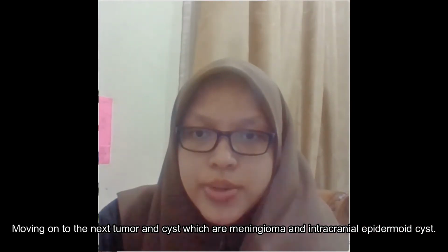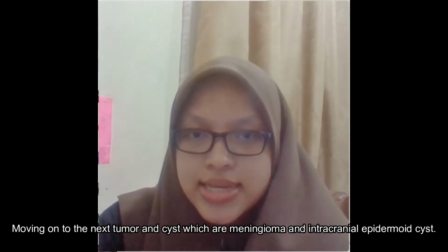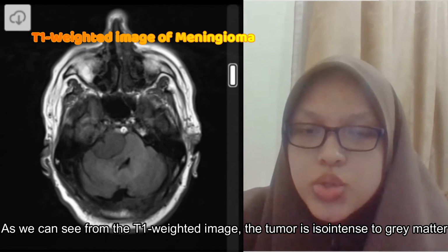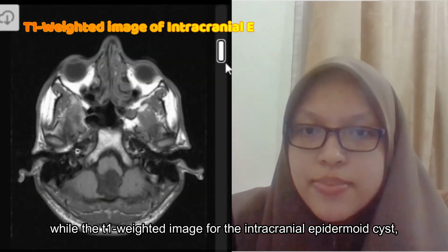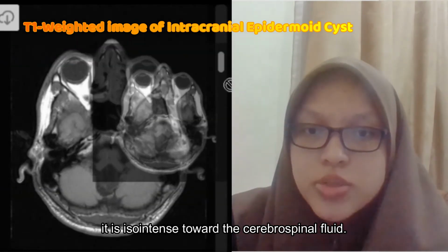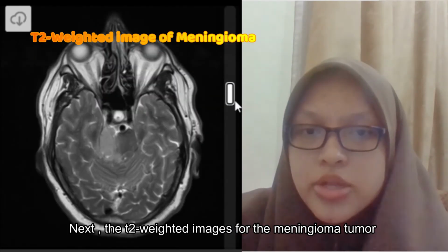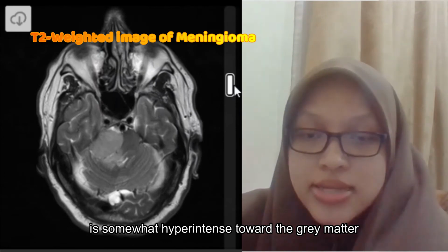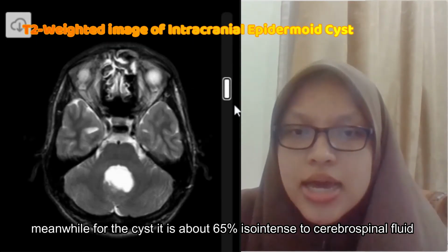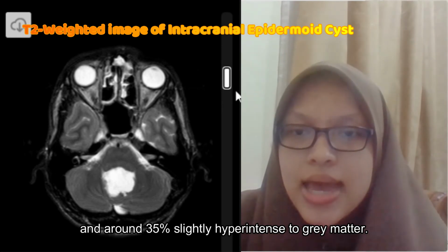Moving on to the next tumor and cyst, which are the meningioma and intracranial epidermoid cyst. As we can see from the T1 weighted image, the tumor is isointense to gray matter, while the T1 weighted image for the intracranial epidermoid cyst is isointense to the cerebrospinal fluid. Next, the T2-weighted image for the meningioma tumor is somewhat hyperintense to the gray matter. Meanwhile, the cyst is about 65% isointense to the cerebrospinal fluid and around 35% slightly hyperintense to the gray matter.